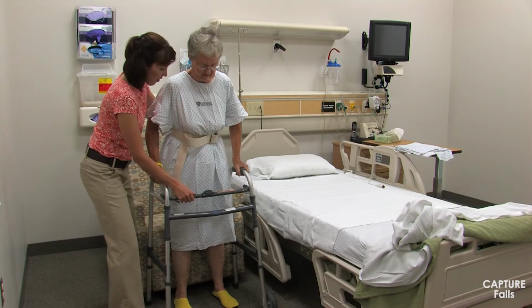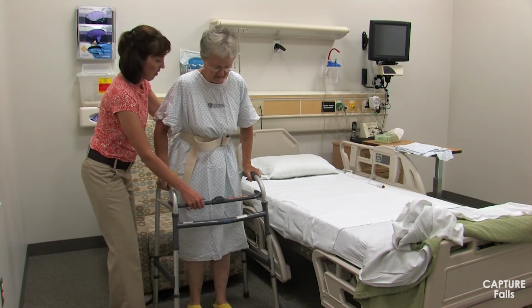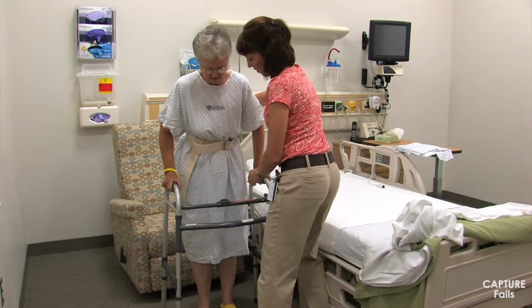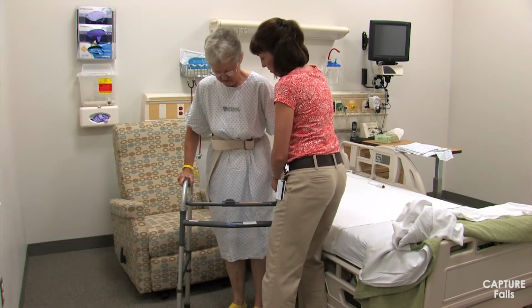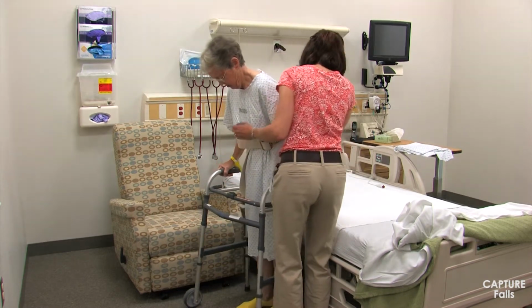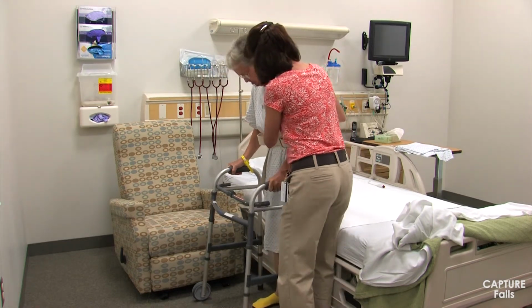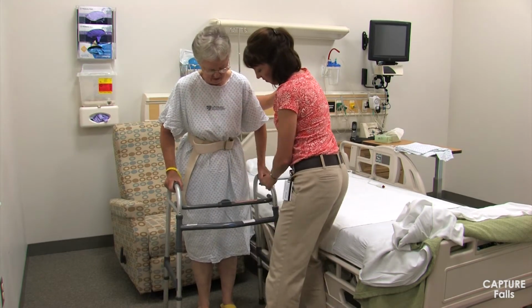Have the patient take small steps to move her feet toward the bed. She should push through the walker as she moves her feet, as that is the function the walker serves, to take some of the weight off of the lower extremities and also assist with balance. She should also move the walker along with her, keeping her feet inside the walker as she turns. Move along with the patient as she turns, staying along her side, keeping one hand on the gait belt and the other hand near or lightly touching the trunk or assisting in moving the walker. You'll notice in the video that I switch sides in order to stay close to the patient but not get stuck between the patient and the chair.